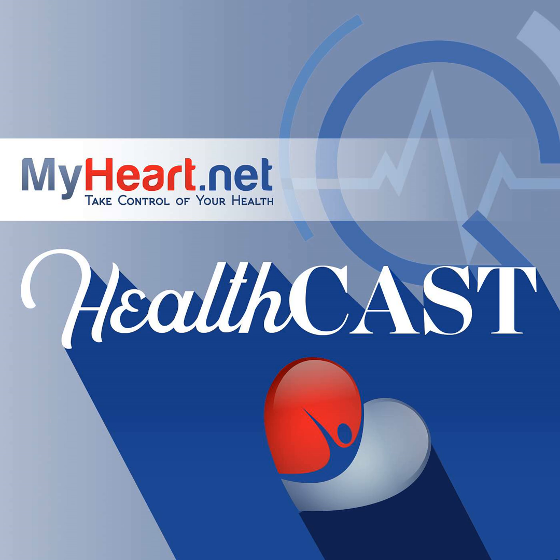Very good. So that's our first segment on the calcium score. I think it's a study that is very quick. It's usually gated to the electrocardiogram, takes about 10 to 15 minutes, and provides a lot of information and really helps us reclassify the risk of a patient that is asymptomatic and has not had any evidence of coronary artery disease.